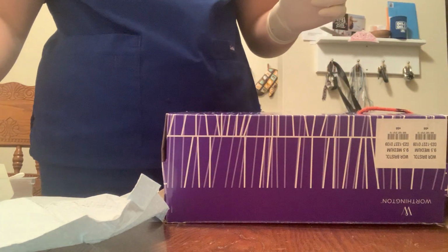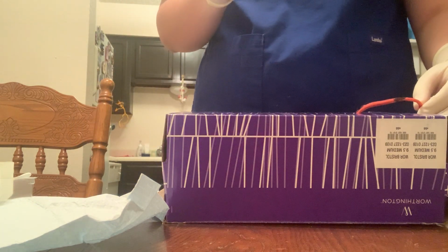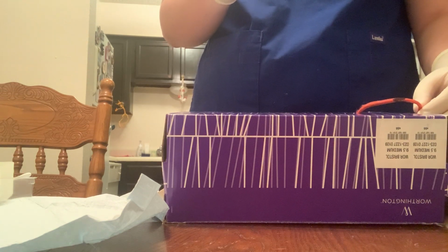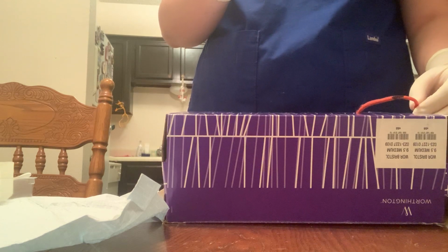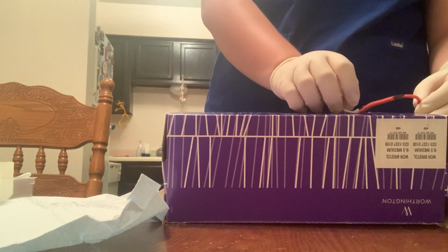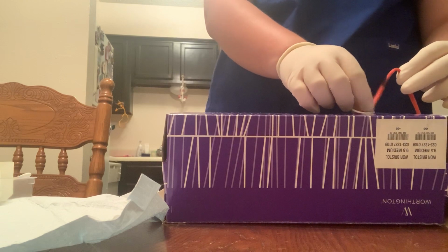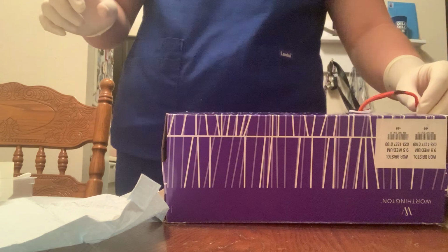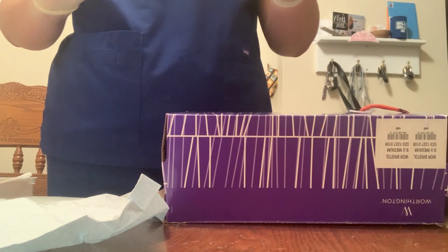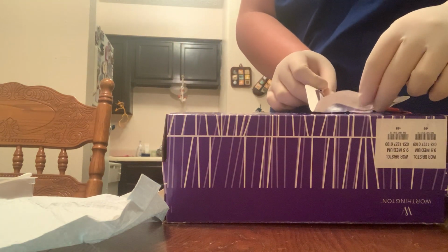The next thing I would do is apply my bio patch. And my left hand is contaminated now, so I'd make sure not to touch anything with my left hand. My bio patch is applied. So the next thing I would do is apply my Tegaderm. I would make sure not to go past the black mark.